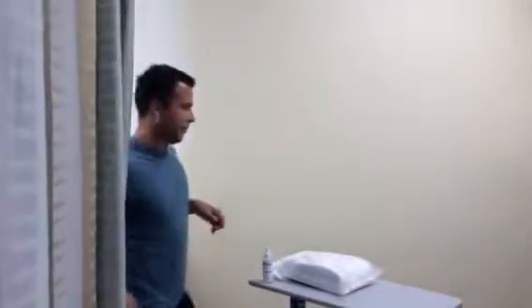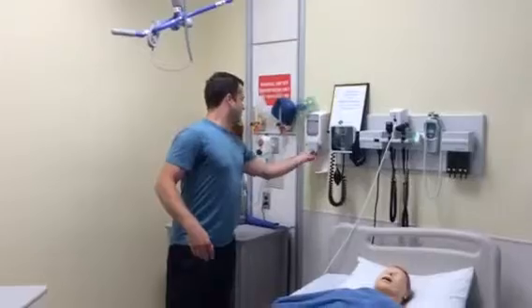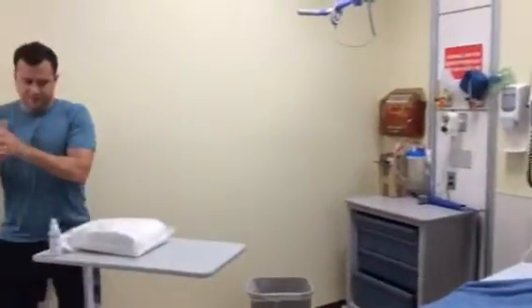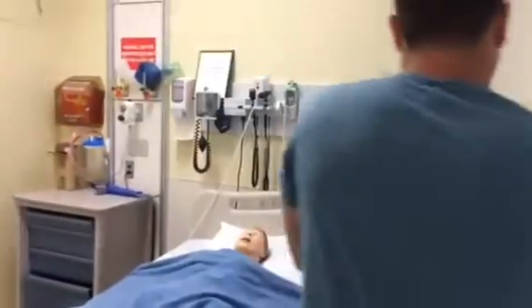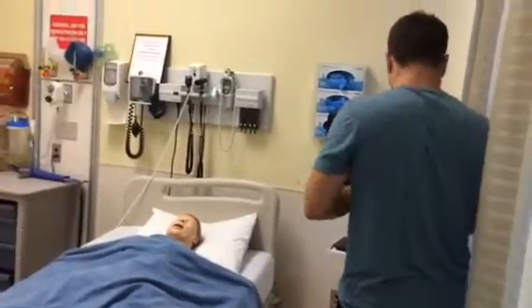Hello, how are you? My name is Paul. I'll be your student nurse today. Clean my hands. Can you give me your name and date of birth, please? Thank you. And let me check your order here today.